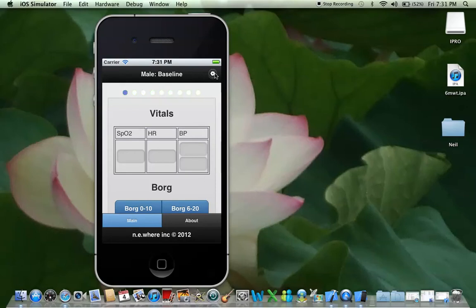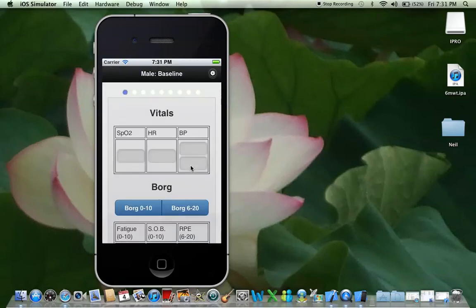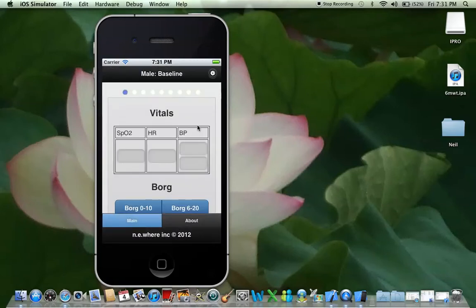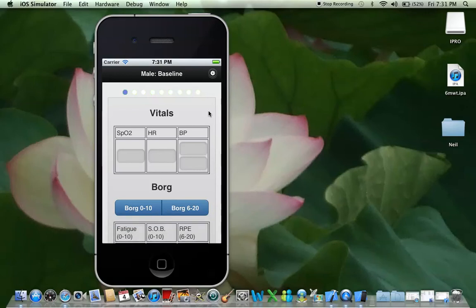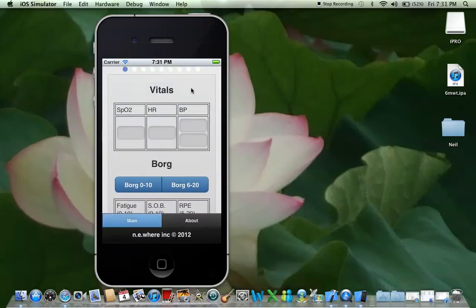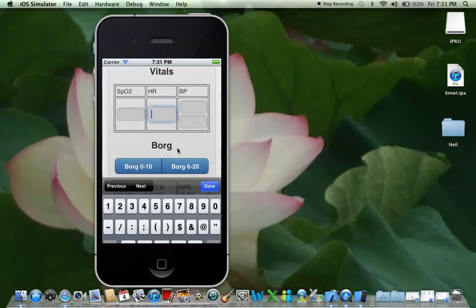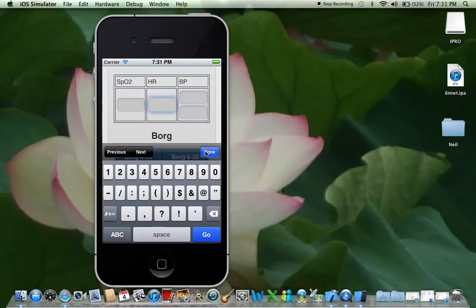The cog is your stopwatch — we don't need that just yet, so go back. As you may have noticed, there's this menu down here: the main and the about menu. If you touch the screen without touching the text boxes, the menu can be enabled and disabled. If you click on a text box, obviously the keyboard's going to come up.